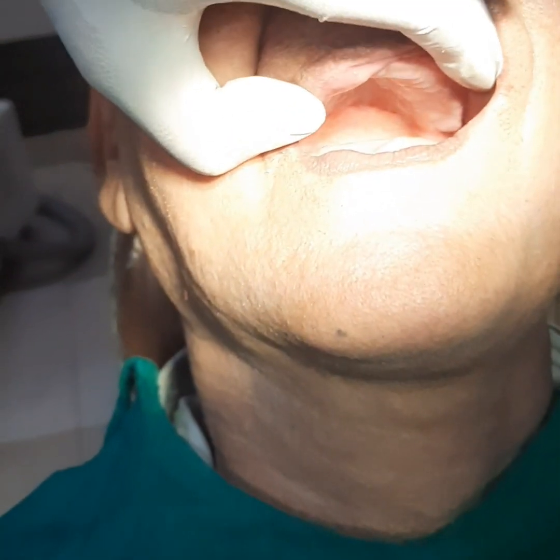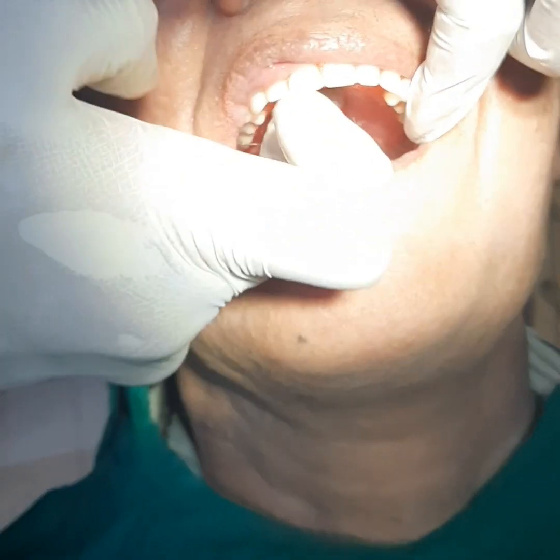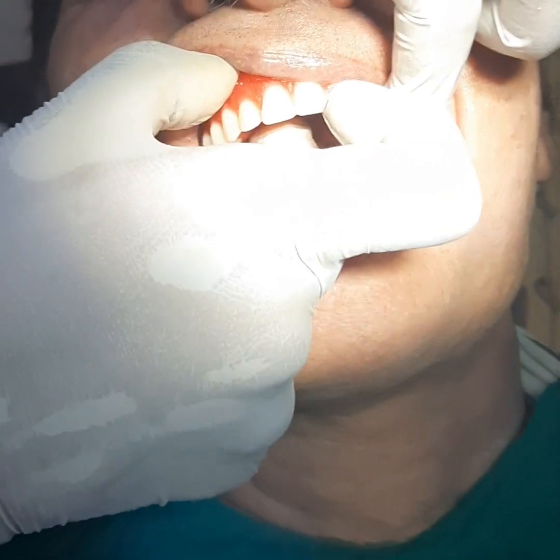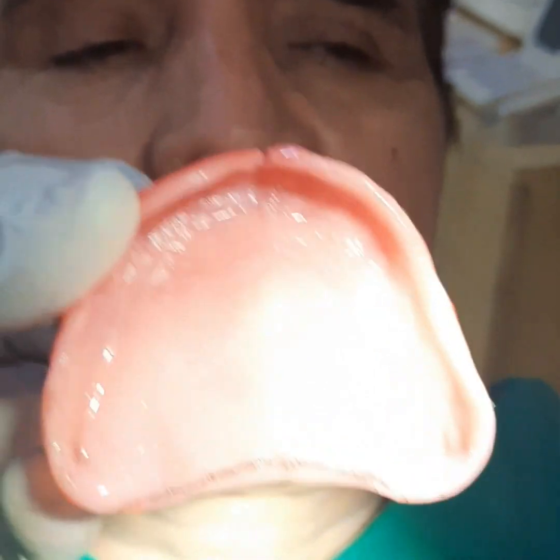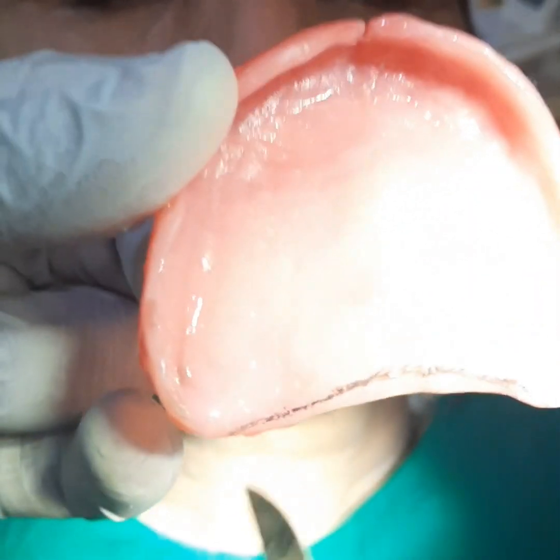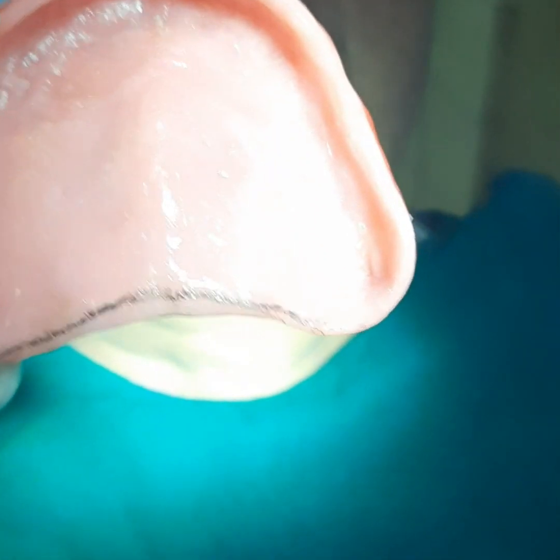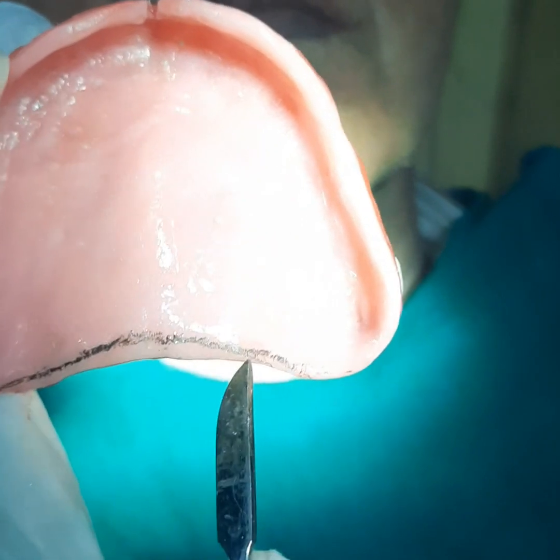That will be the extent of your maxillary denture — confirm it, open. You are going to transfer this mark onto the denture base. Once you have transferred the posterior palatal seal mark, you can see the posterior end of the denture base, and this is the axis. You are going to trim according to the resiliency; you can even scribe the cast so that you have the positive border of the denture in the final process.